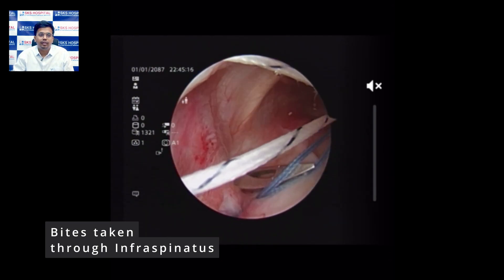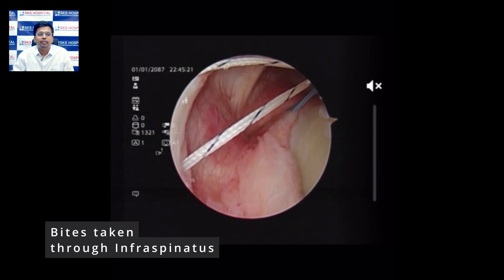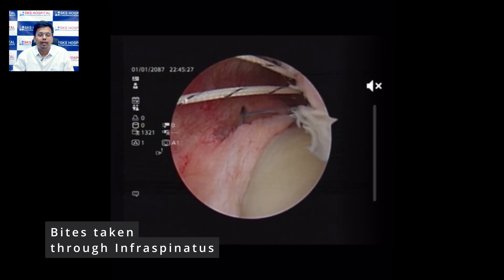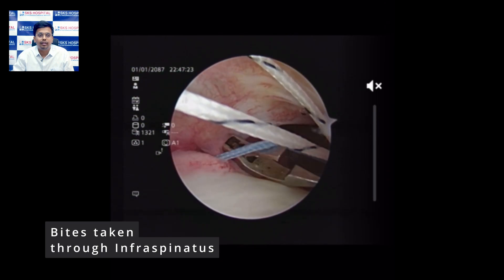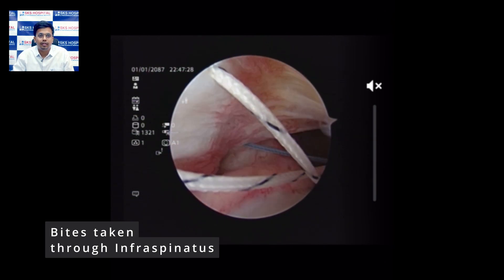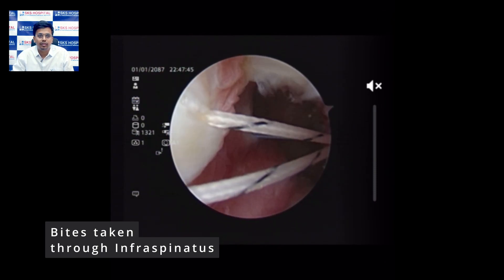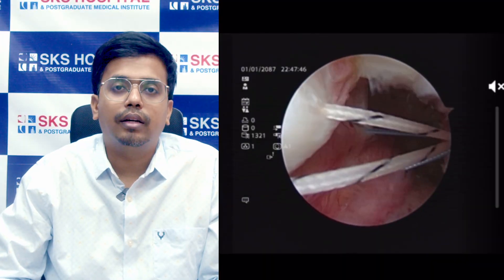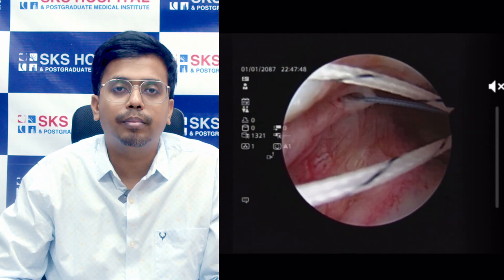We repeat the same steps with the blue suture anchor thread. The first bite is taken and the suture thread is retrieved. We then pass the bird beak inside again, take one more bite, and retrieve the last suture thread, again ensuring we hold the previously taken suture so the anchor thread does not get dislodged. With all four bites taken, the construct now looks like a parachute — which is why we call this the parachute technique.